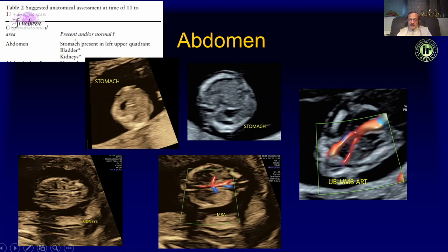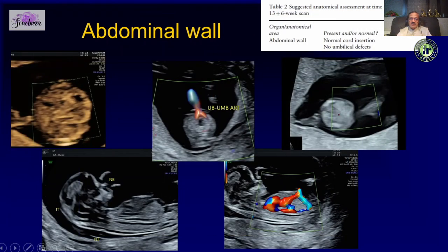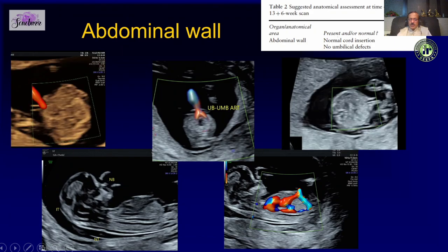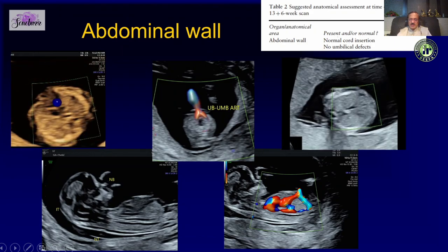The kidneys can be seen — in fact here is a 12 weeks 4 days fetus where we can see both kidneys with high-resolution flows, a little renal pelvis, and even the renal arteries at 12 weeks 4 days. We can pick up gross renal anomalies and bladder abnormalities — megacystis can be picked up at this stage as well.